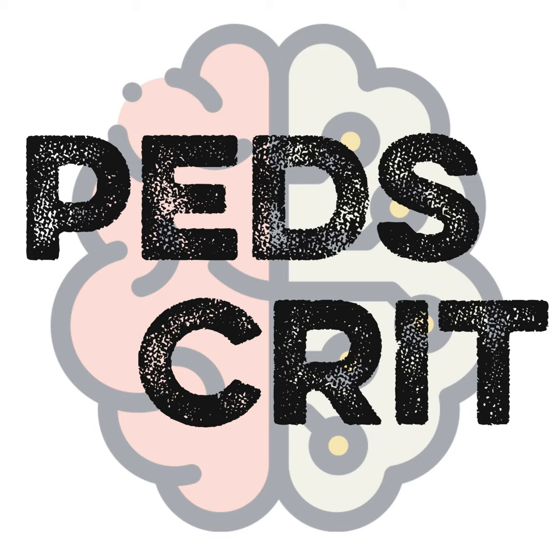It also makes sense that in the youngest, the babies, really their cervical vessels are the ones that are actually large enough to take these catheters. So an IJ and carotid approach is going to be the most common approach for peripheral cannulation. And then in the bigger kids, the adolescents, the femoral vessels become an option.